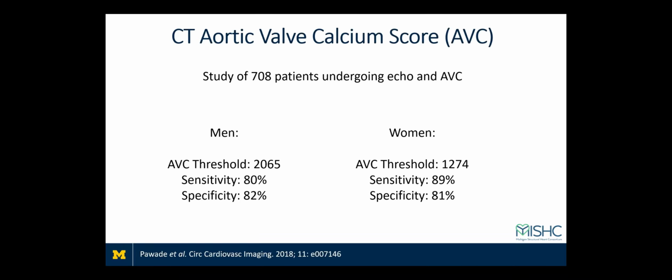So just a word about CT aortic valve calcium score. So this is based on multiple studies that have evaluated this and using CT to be able to derive a calcium score of the aortic valve. The largest study that has studied this is summarized here, where they used patients that had echoes with agreement between their gradients and their aortic valve area as the basis for the diagnosis of the AS, and then they looked at what the valve calcium scores were.